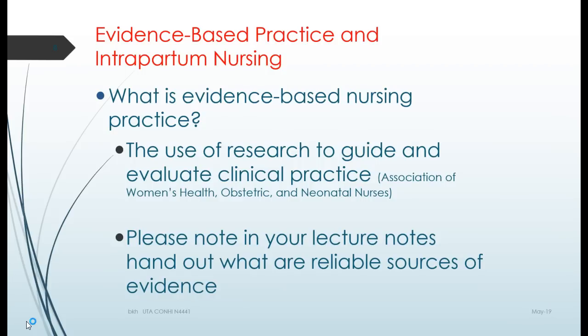So hopefully you have heard about evidence-based practice prior to today. What is evidence-based practice? It's the use of research to guide what we do in our practice. The evidence-based practice for fetal monitoring comes from AWHONN, which is the Association of Women's Health, OB, and Neonatal Nurses. That's my professional nursing organization.